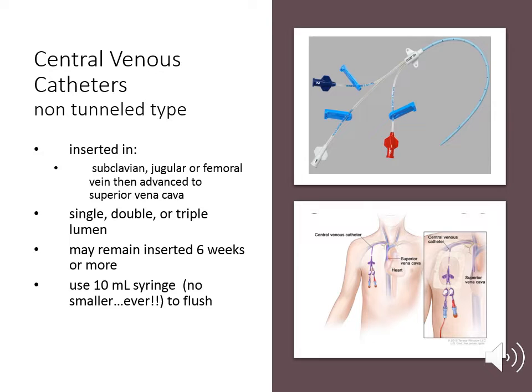You want to always flush immediately after an infusion. An empty fluid container bag lacks the pressure, and the blood can backflow into the lumen, causing an occlusion. Prior to inserting any syringe into the end cap, we should always scrub the hub. With a central access device, you are always going to use some type of chlorhexidine swab. They vary depending on facility. You want to scrub vigorously for 15 seconds and then allow to dry for 15 seconds.